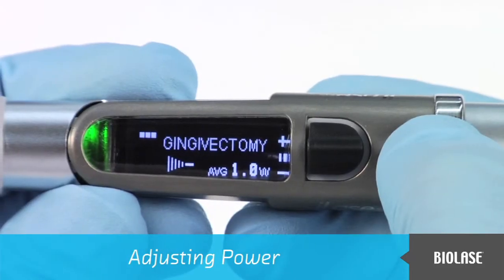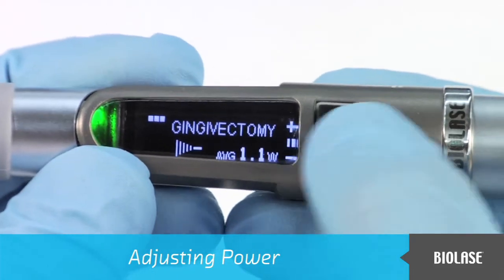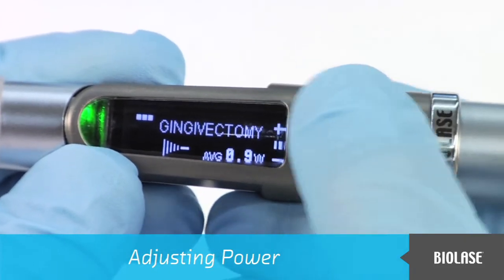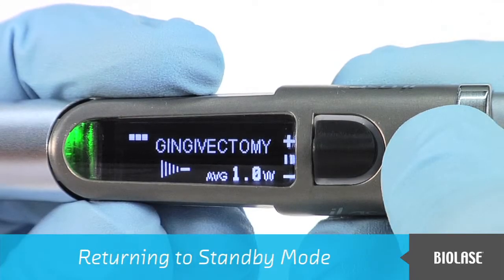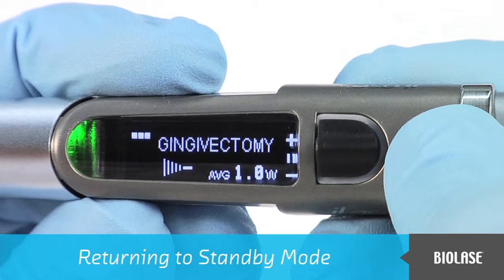Power can be adjusted during ready mode. First, make sure that you are not firing the laser. Then push the black navigation button up to increase power, or push the button down to decrease power. The display screen will show the power level. Placing the iLase into standby mode allows you to adjust all parameters of the system, including power. The iLase cannot be activated during standby mode.